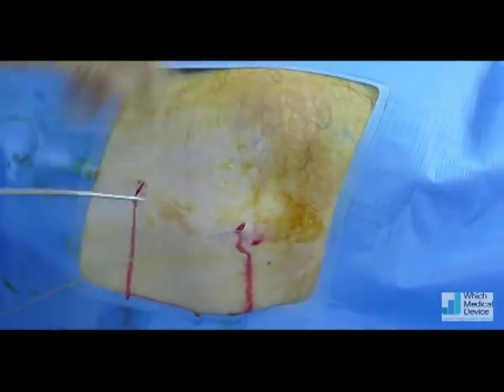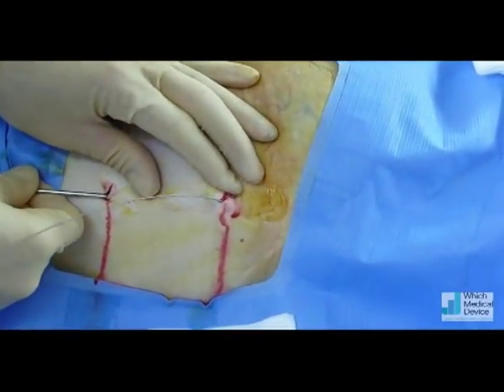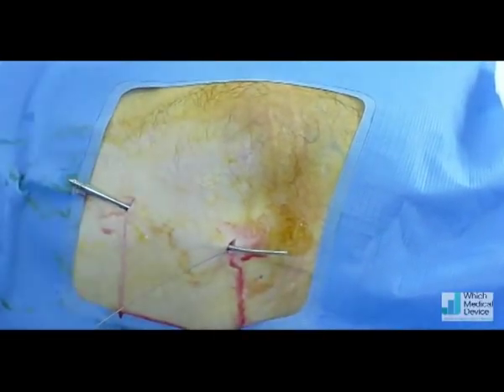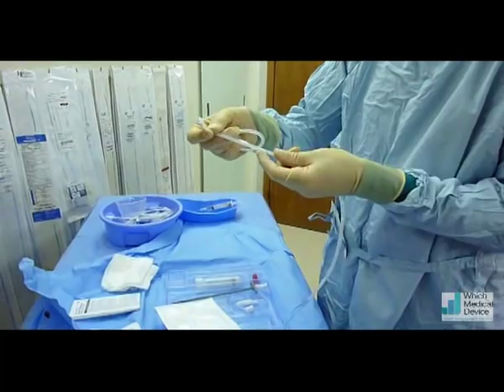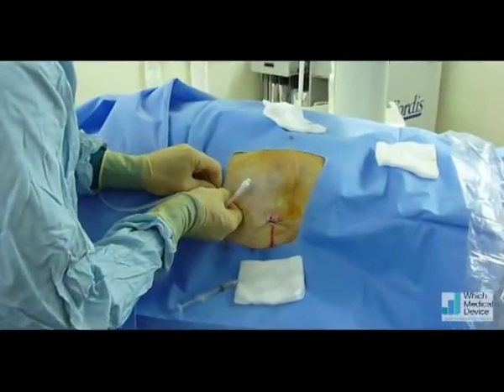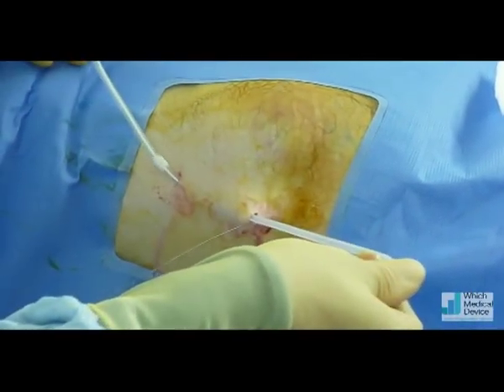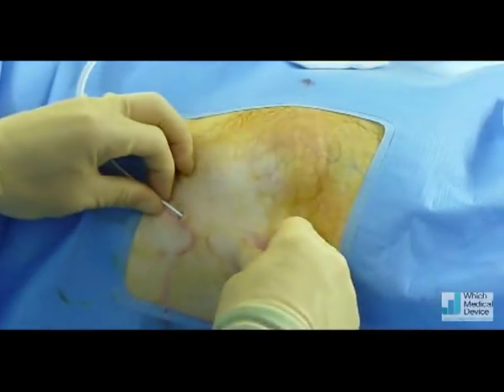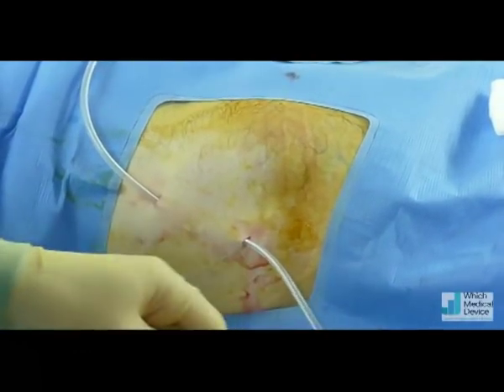There's a slight bend on the needle so I can steer it — there's going to be some pushing now. That's the tunneller through. We're now going to connect up the PleurX catheter. You can see it has a cuff like a dialysis line would have. That's connected to the tunneller and it's pulled through. Take care not to dislodge the wire in the process. I'll leave the cuff about two or three centimetres down the tract — about there. You can feel the cuff; it's about halfway along the tract in this situation. Take the tunneller off — ready to insert the line.